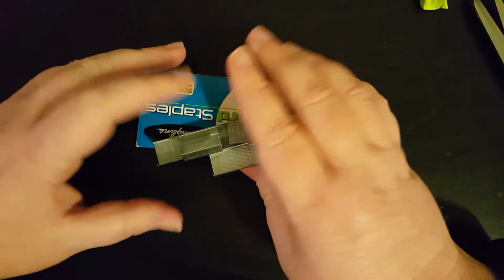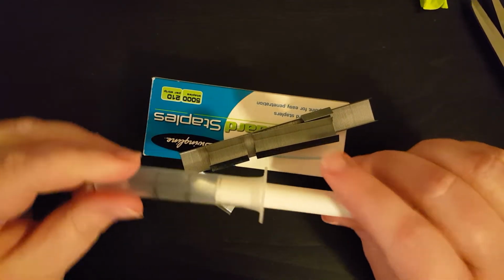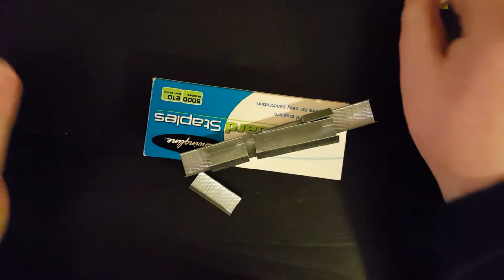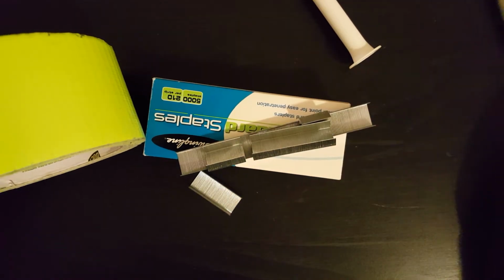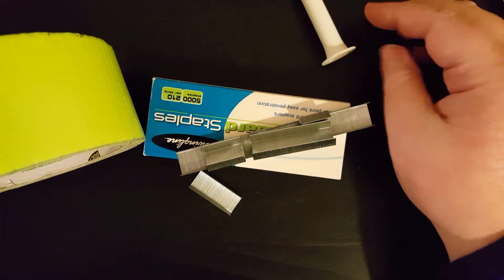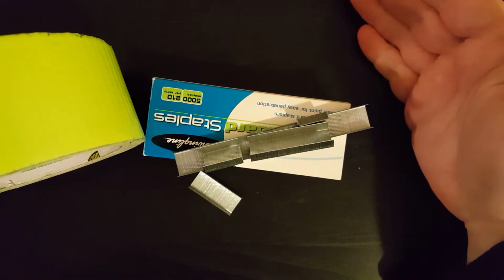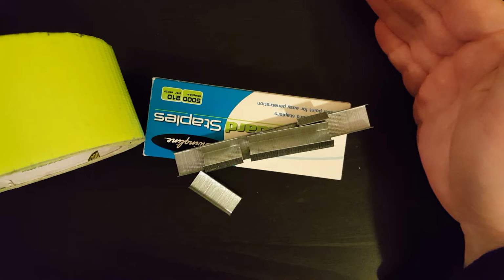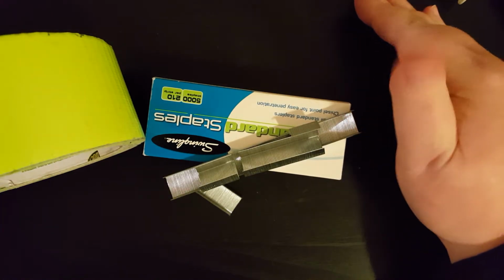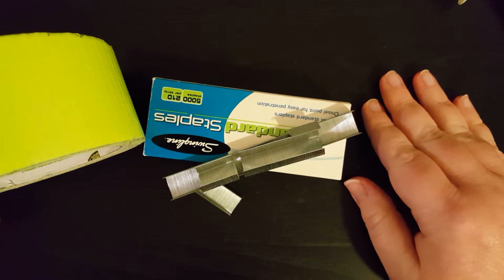What we're going to need for today's lesson is a box of staples, a syringe of whatever type you want to use, duct tape, and scissors. You'll also want to choose some type of labeling technique, whether you're a Braille user, a large print label user, maybe you're doing something like an audio labeling device. Whatever your choice is, whatever will make this easy. Anyway, moving on.